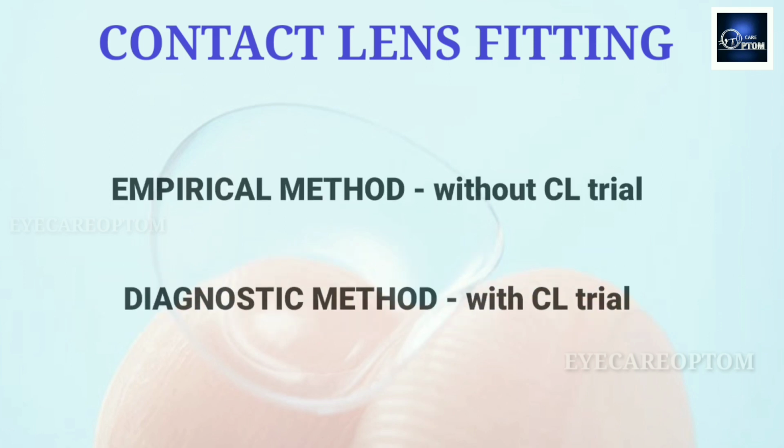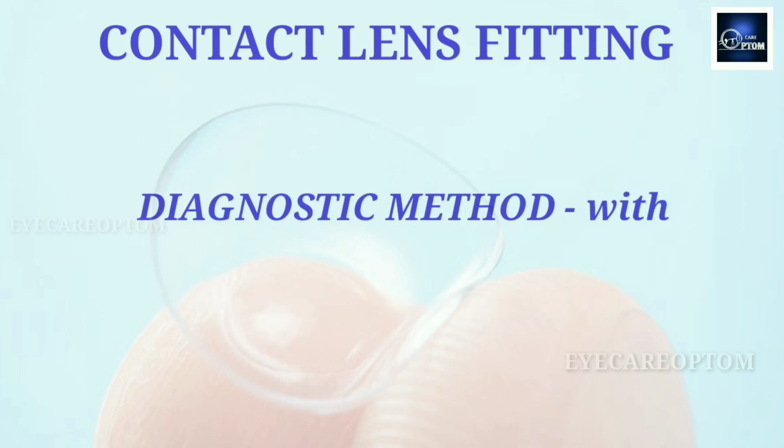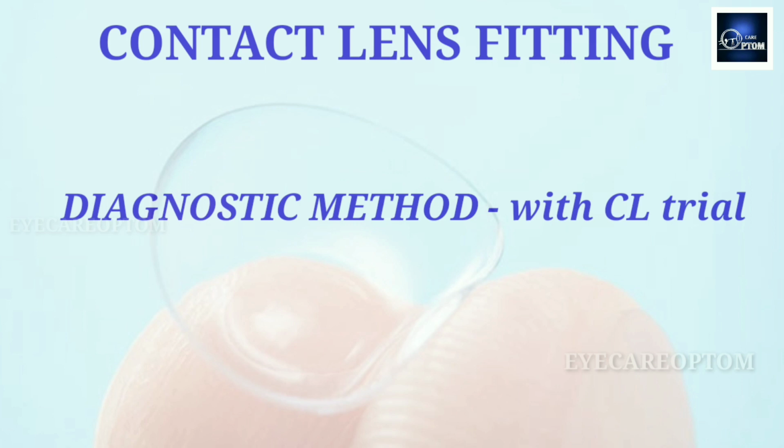In empirical fitting, we prescribe the contact lens power without any contact lens trial. But in diagnostic fitting, we prescribe the final contact lens after a contact lens trial. In practice, this diagnostic fitting method is followed as the standard method by contact lens fitters.